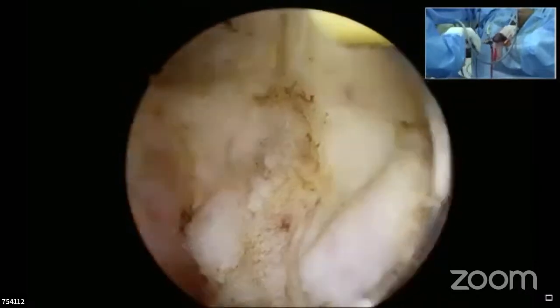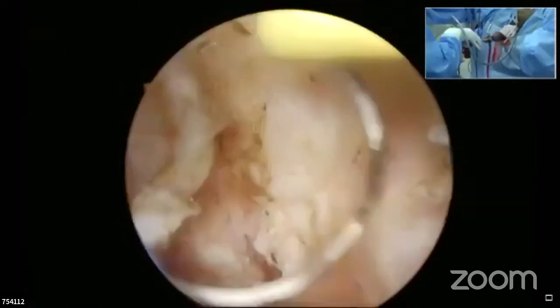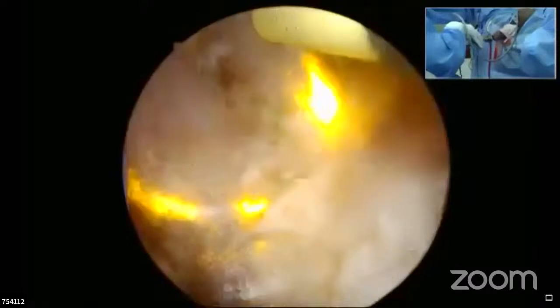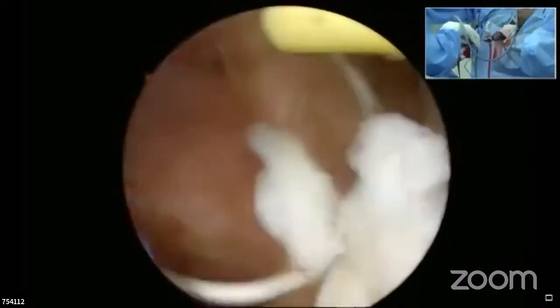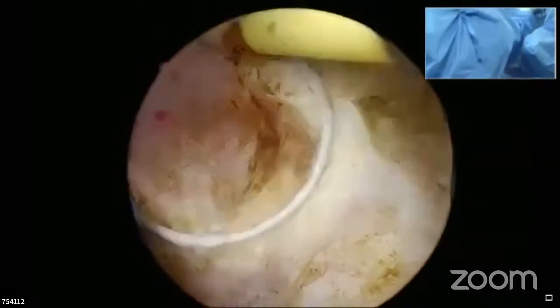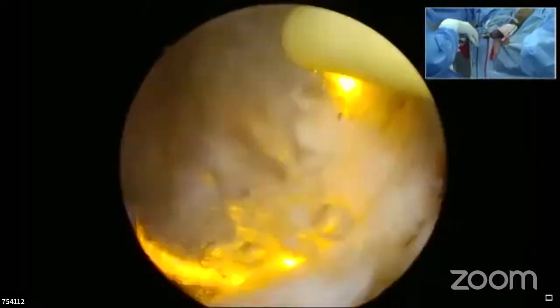There's a question from Anuj. The gland which is extending beyond the verumontanum, can we resect it safely? He wants to know whether you need to shave it or how much depth he should go to prevent incontinence also. Taif, if you can answer, and after that Dr. Gupta and Dr. Kirpekar can add.